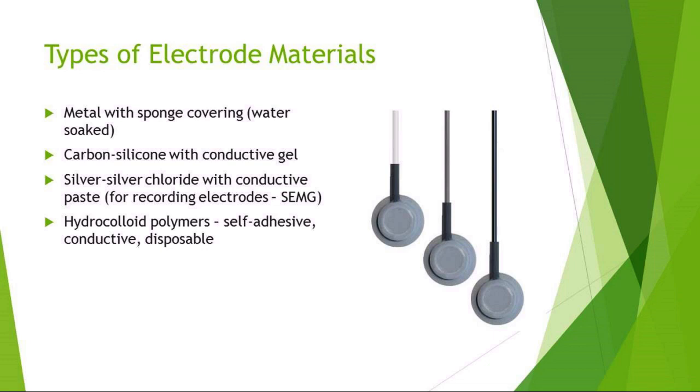And so when we get into lab, each of you will get some sets of electrodes that's yours. You do not want to use electrodes between two people. So you're going to use your electrodes on you, and somebody else is going to use theirs on them. You're not going to share electrodes. You see these most often in the clinic. And in our clinic, once we use a set of electrodes on a person, we keep the electrodes with that patient's chart. So if we are going to use them again the next time, we use the same set of electrodes until they wear out, and then we throw them out and get new ones.